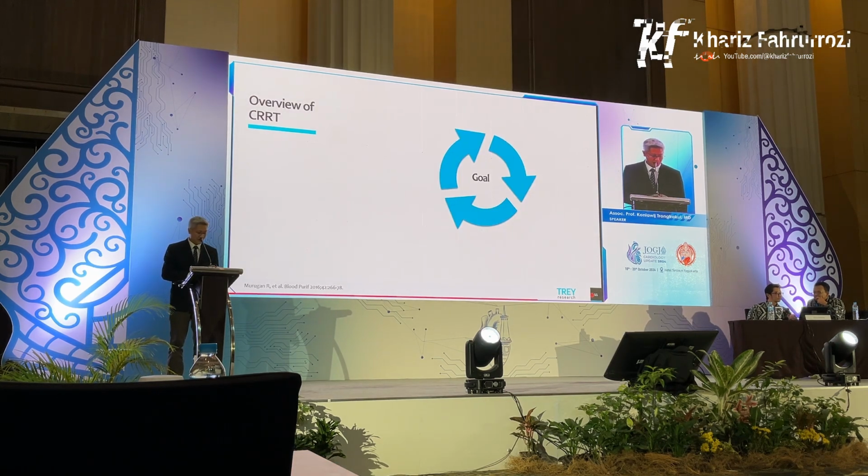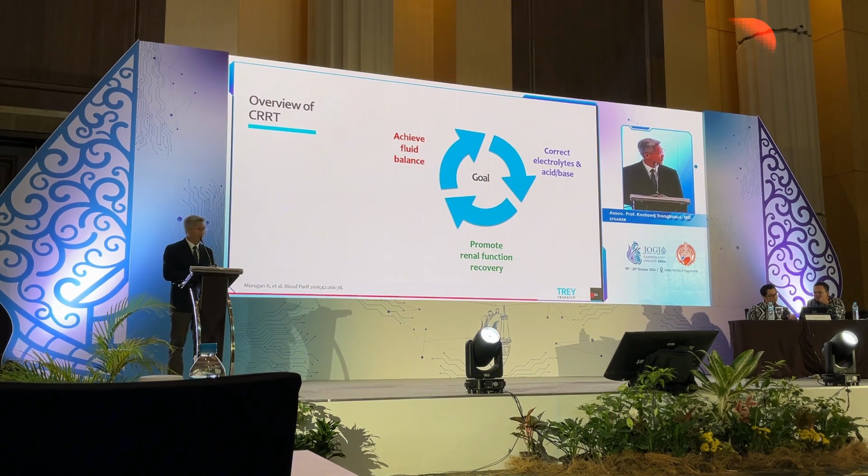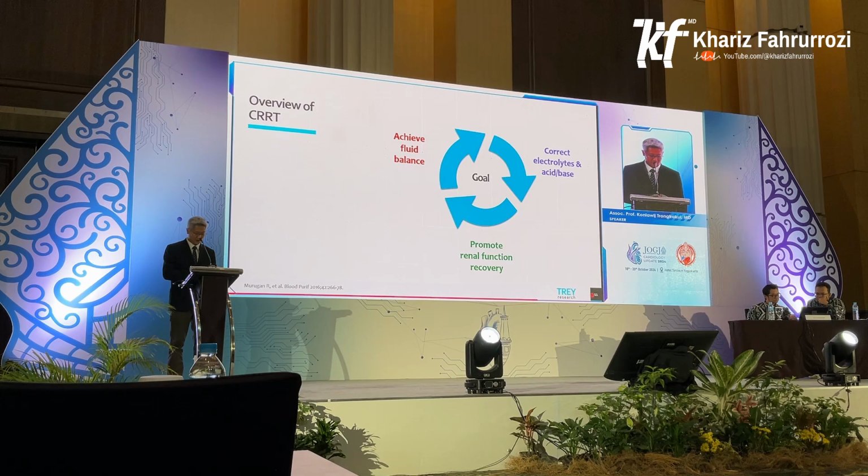The overview of CRRT: the goal of CRRT is to correct electrolyte and acid disturbance, and to correct the fluid status of the patient and also promote renal function recovery. We don't want our patient to be dependent on CRRT. Why do we choose CRRT?